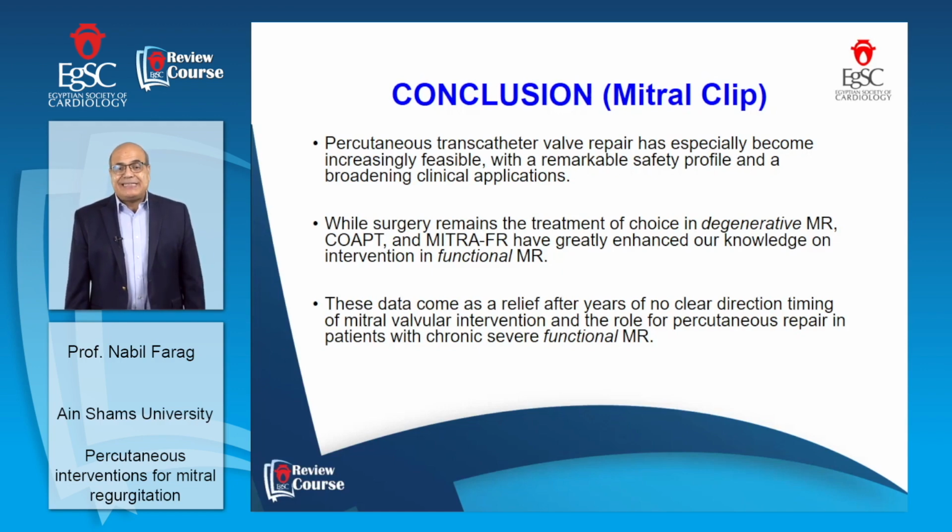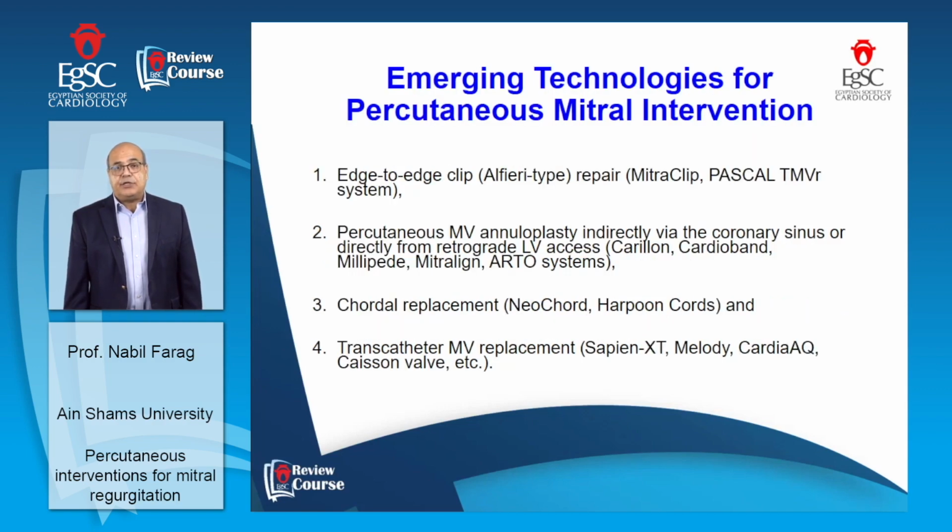While surgery remains the gold standard, or the treatment of choice, in degenerative mitral regurgitation, now we have the COAPT trial that has greatly enhanced our knowledge of intervention in functional mitral regurgitation. These data come as a relief after years of no clear direction on the timing of mitral valve intervention and the role of percutaneous repair in patients with chronic severe functional mitral regurgitation.